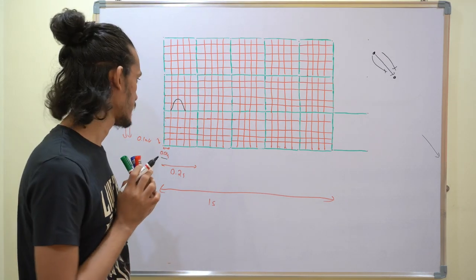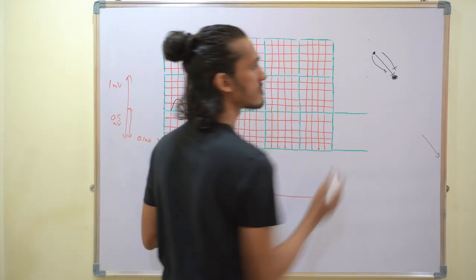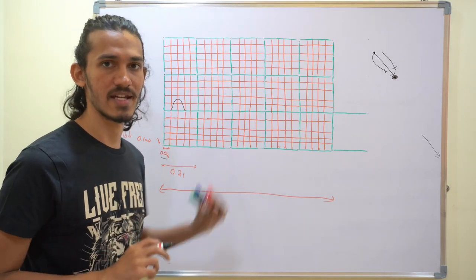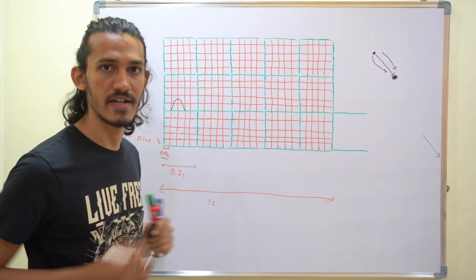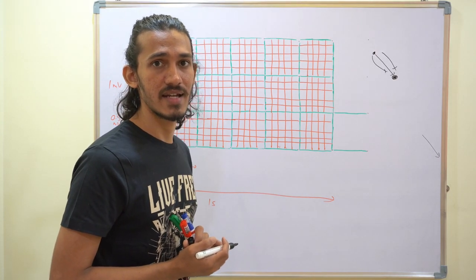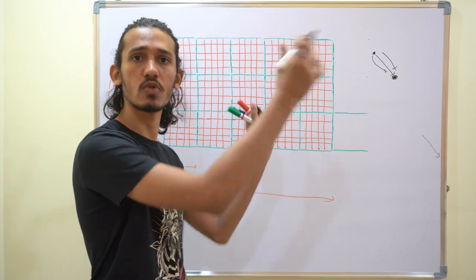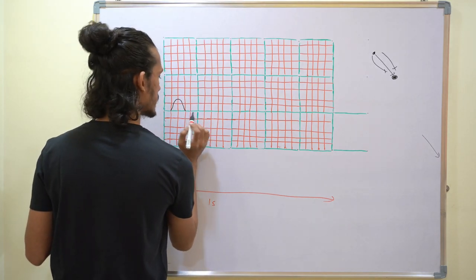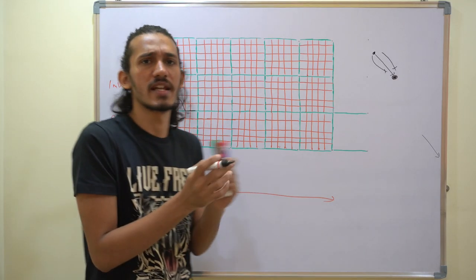Okay. After that, there's something called the AV nodal delay. Atria is already activated, atrial depolarization is done. The ventricle hasn't started depolarizing yet, it hasn't reached the ventricle. So it gets stuck in the AV node. So that will not be a wave, it will be an isoelectric line, with no electrical potential because no depolarization is taking place. So that will be the PQ segment. That can be 1 to 2 divisions.